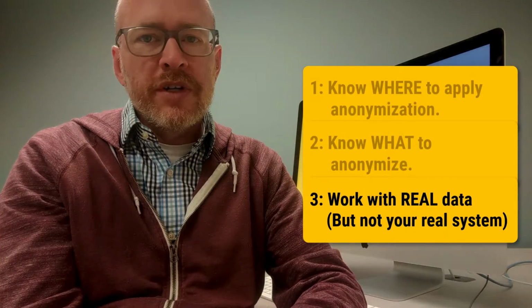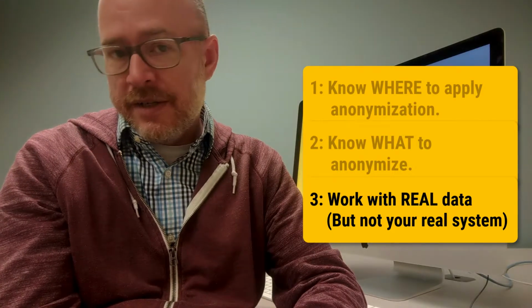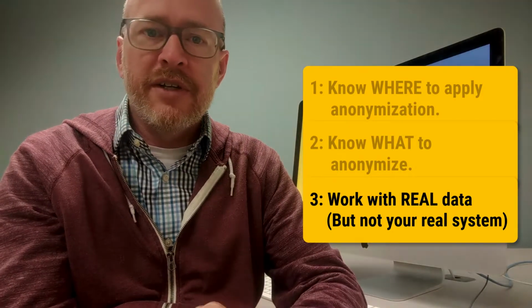Third, start working with real data, but not your real system when you're developing your anonymization scheme. Closely inspect your DICOM data to weed out the PHI that can be buried deeply within it. And this is really only possible when you're dealing with actual DICOM that comes off of your scan sources.